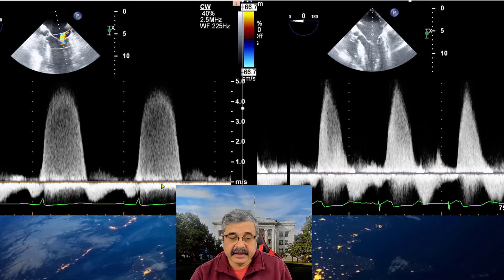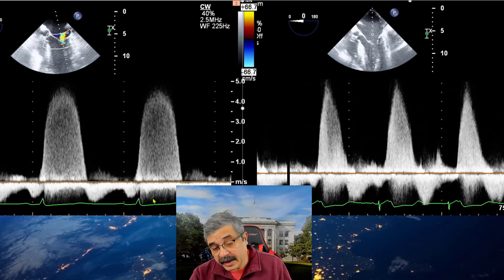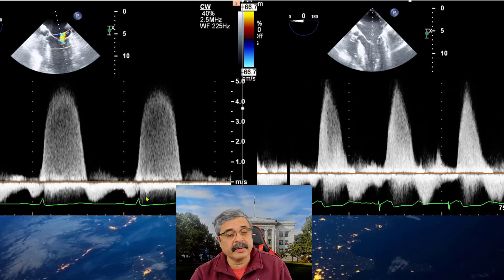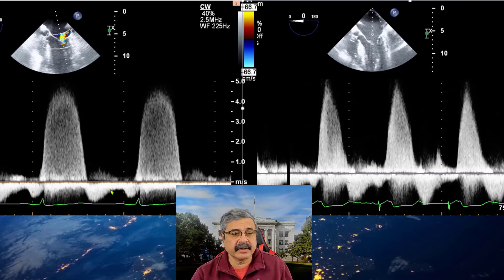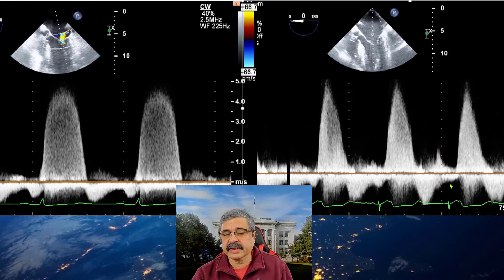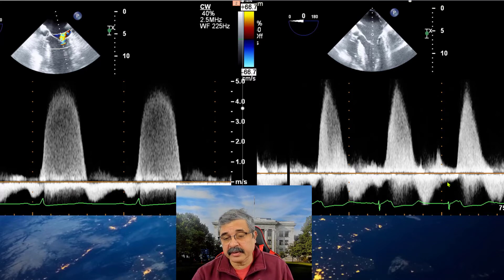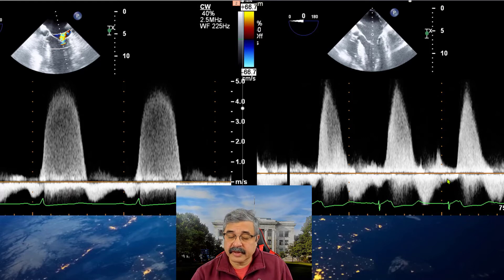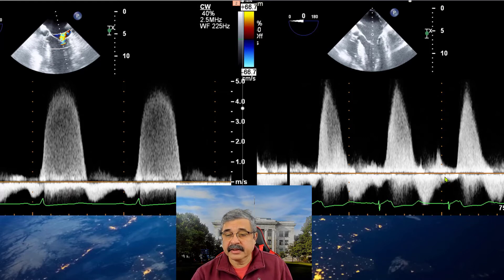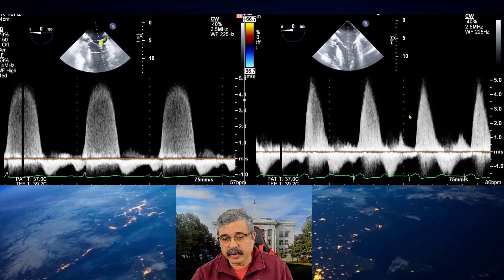In this case, it's not entirely an atrial-dominant pattern, but it does demonstrate some impaired relaxation. On the right side, as you can see, there is a significant E-dominant transmitral flow pattern, implying that there is greater volume going through the mitral valve.